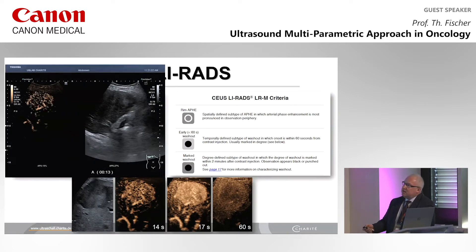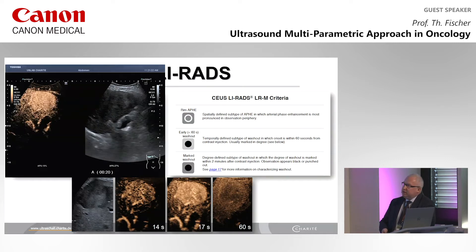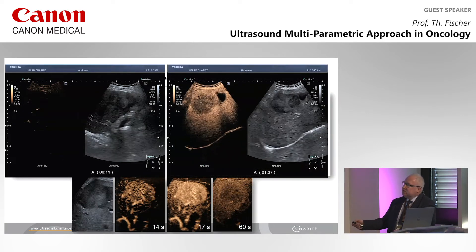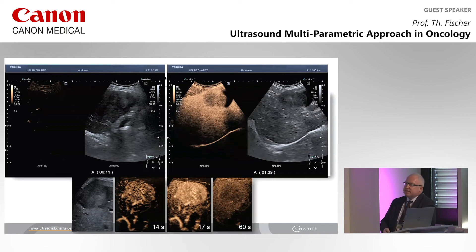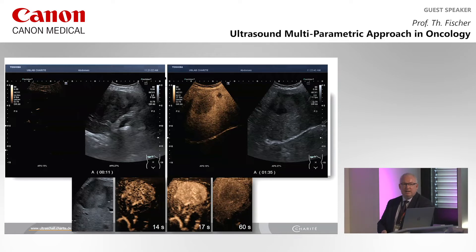This is how it looks like in real-time split-screen mode: early inflow, highly vascularized, very well depicted with the system so that you have a full and clear view on the lesion itself. At 1 minute 37 seconds, we have this clear washout of the lesion, which is very important to define a malignant one. In this particular case, this should be an HCC after the staging procedure or after the LIRADS classification.